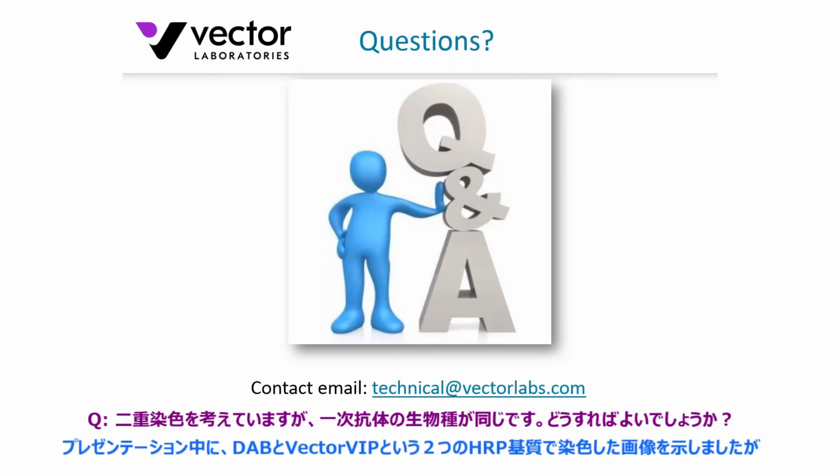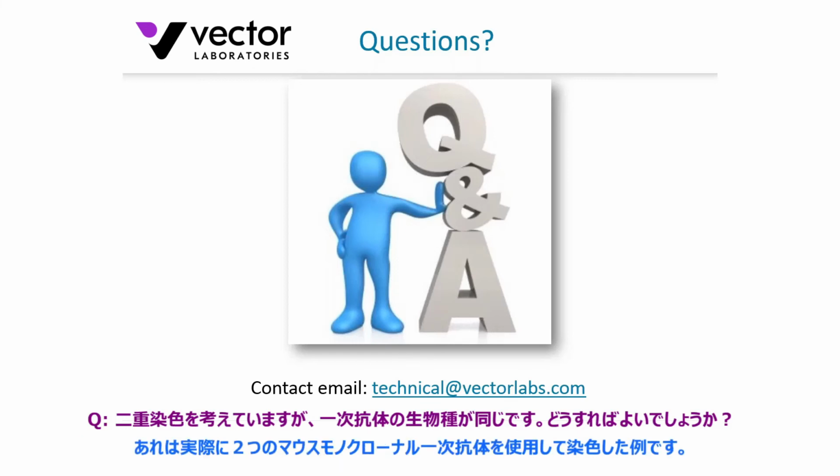Indeed, in the presentation earlier on, I did show an example of 2 HRP substrates. I believe it was DAB and Vector VIP. They were actually performed using 2 mouse monoclonals, if I remember correctly. So it just gives you a bit of an idea, and they were in very close position to each other. So yeah, certainly sequential labeling would be recommended.